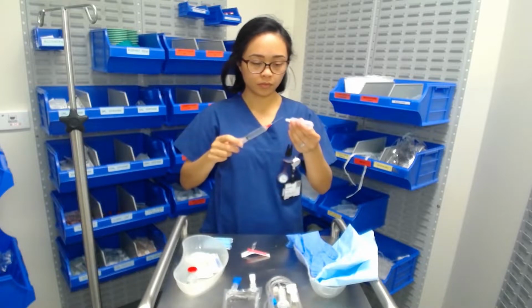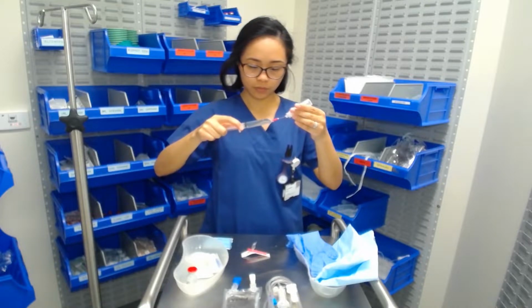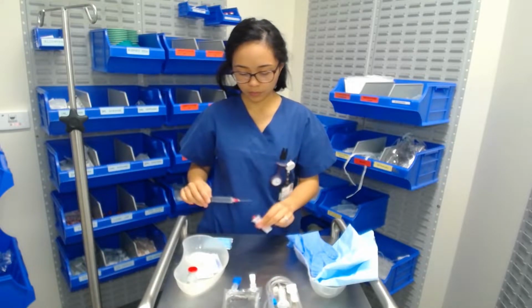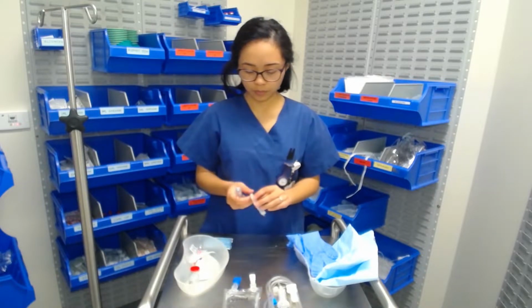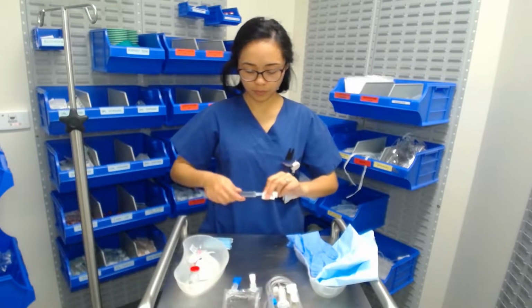But I'm using this to draw up my 10 milliliters of water for injection. This is my diluent. I'm recapping that needle because, as I said, it's blunt. There is no sharp end, but it will go into the sharps container at the end of the procedure.